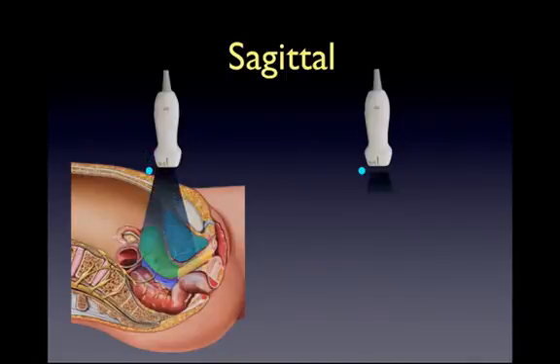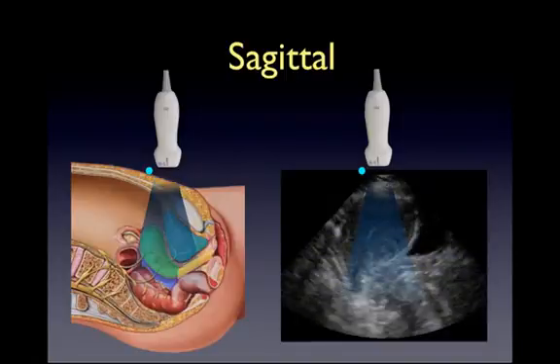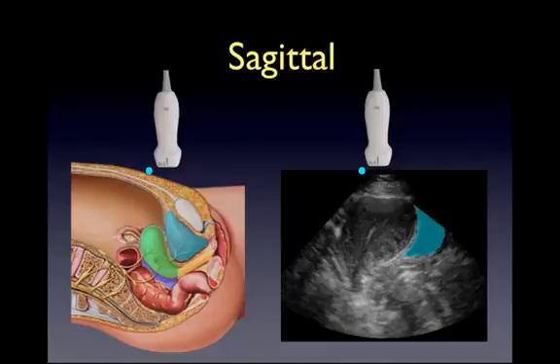In a corresponding ultrasound image, the bladder is identified as a well-circumscribed, fluid-filled anechoic structure. The cervix appears just posterior to the bladder angle, with the uterine body to the left of the angle and the vaginal stripe to the right. Just cephalad to the bladder, the uterus appears as a hypoechoic structure with thick walls and a well-defined border. The posterior cul-de-sac, or the pouch of Douglas, is posterior to the uterus and may be the site of free fluid collection.